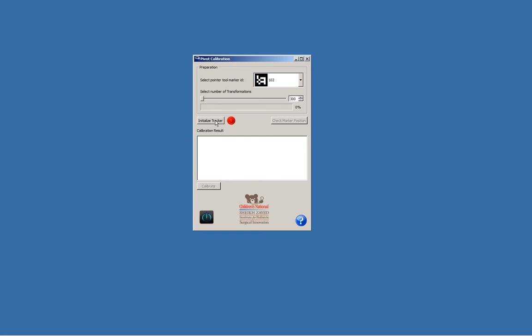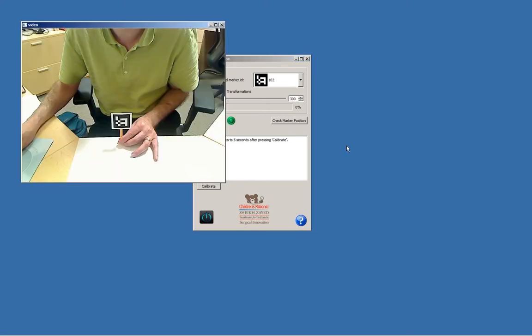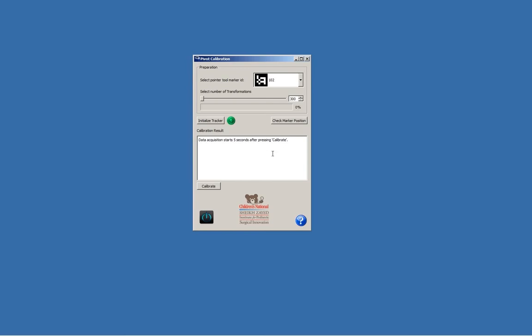We need to initialize our tracker — the LED is green. We also need to make sure that the camera can actually see our marker where we want to do the pivot calibration. We press 'Check Marker Position' and yes, it can see it, so we can proceed. I press the calibrate button and I have five seconds before I actually need to start pivoting.